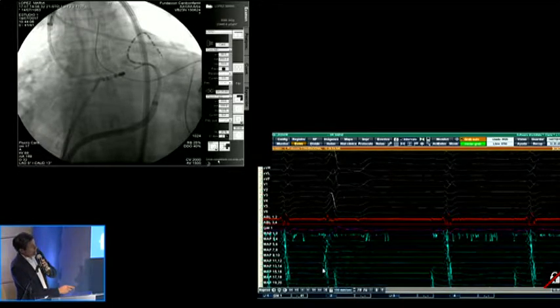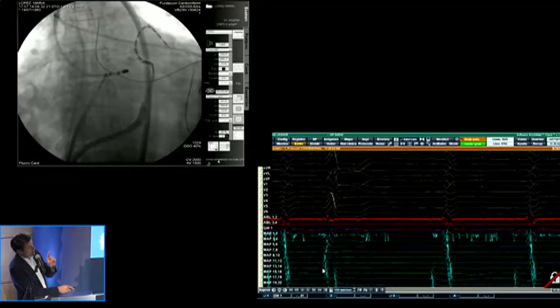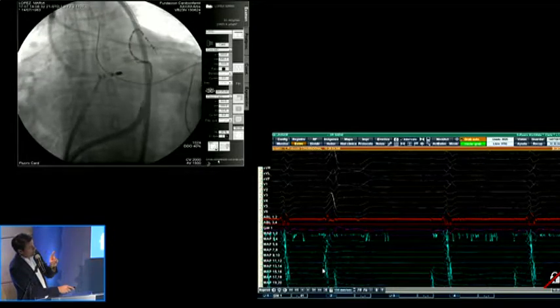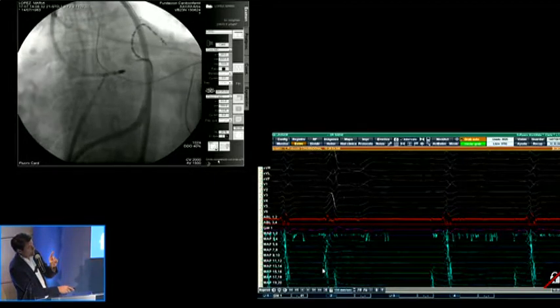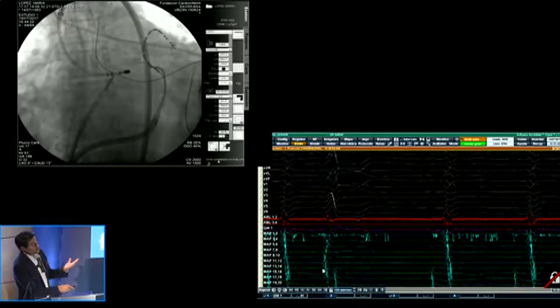Yes, Fermin, this concept is terribly important to explain. Explain to the audience why you think that the first component is a far field instead of a near field, because that's fundamental for the interpretation of where you should do the early intervention. How do you conclude that this is far field and the decapolar is the near field?